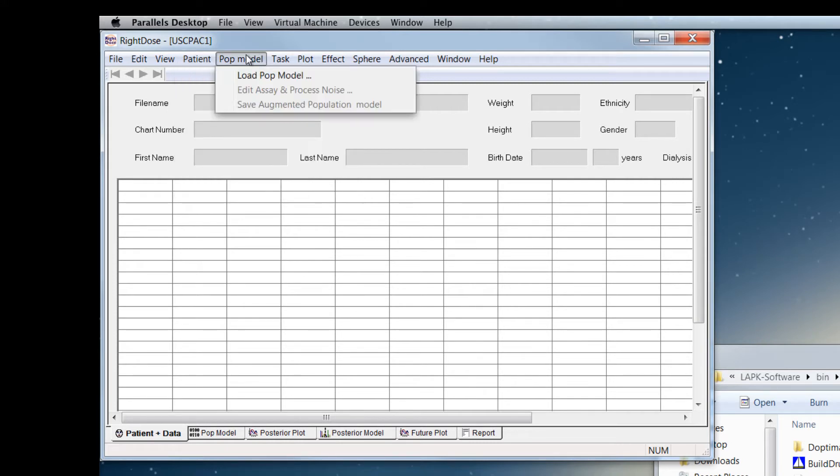The other tab that you'll use or menu item that you'll use frequently is the POP model, and this allows you to load population models.